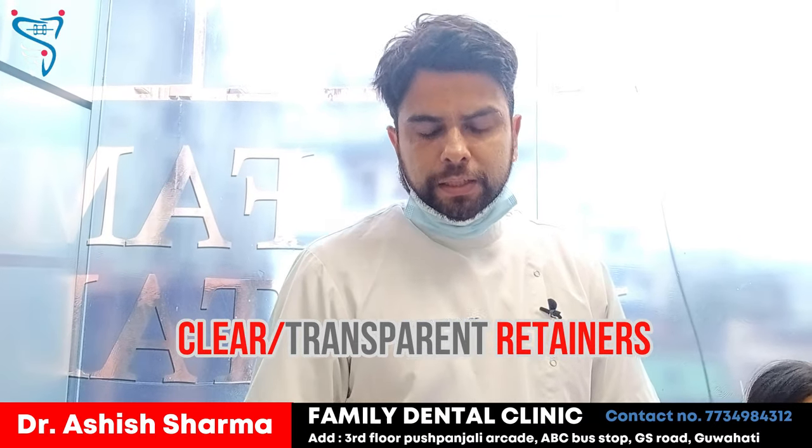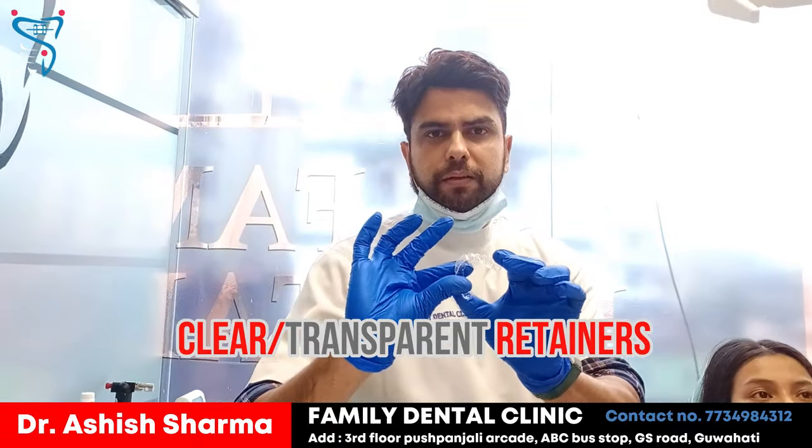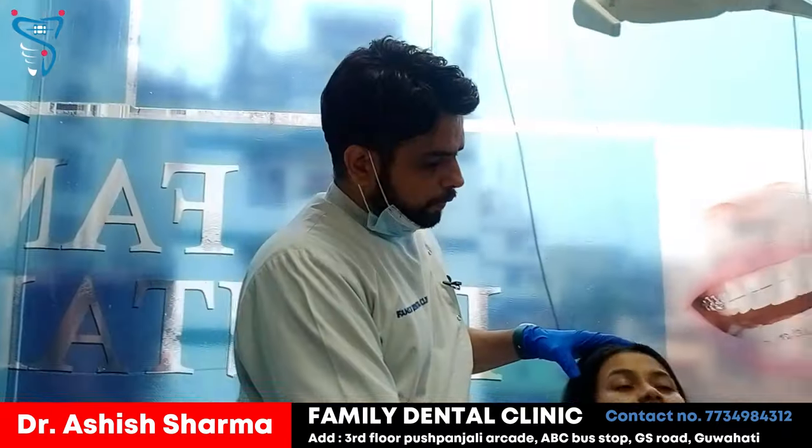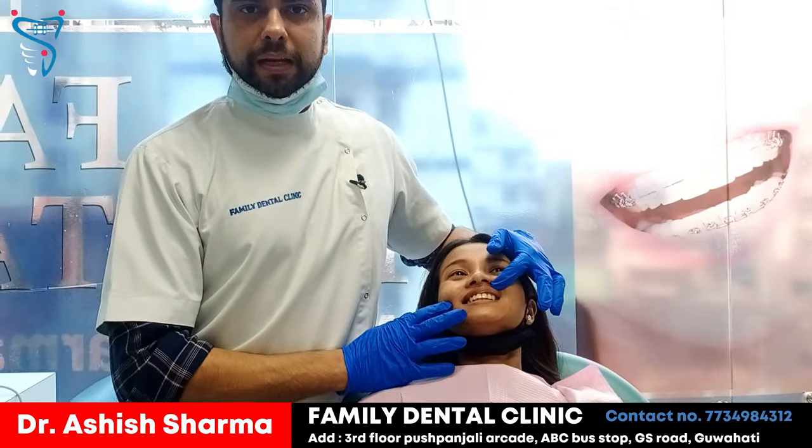These are the retainers which we are going to give to the patient today. As you can see, these are plastic sheets which are completely transparent. They are very comfortable to wear.